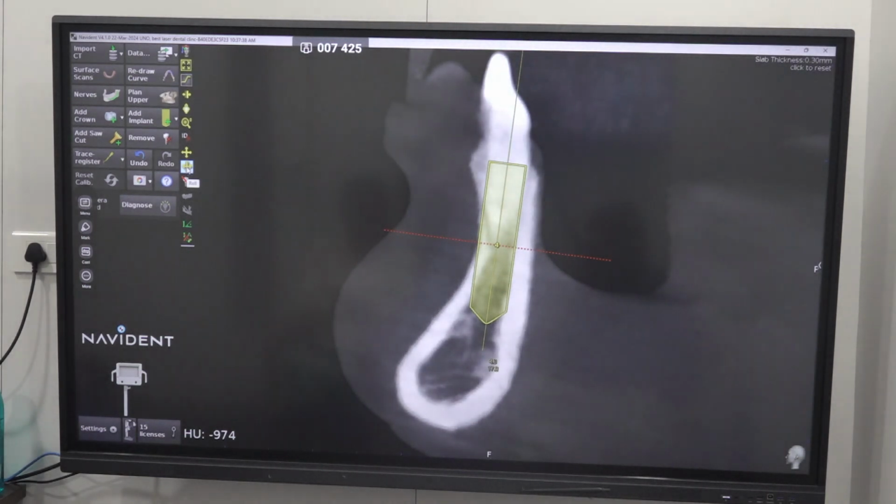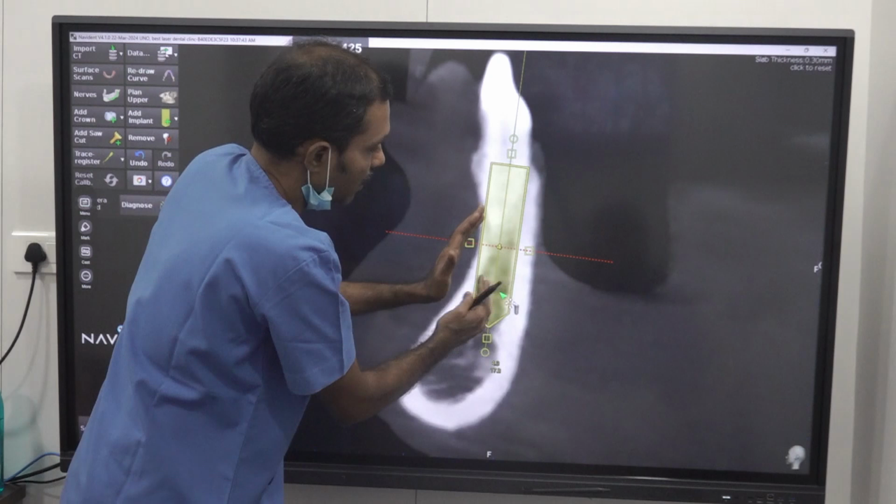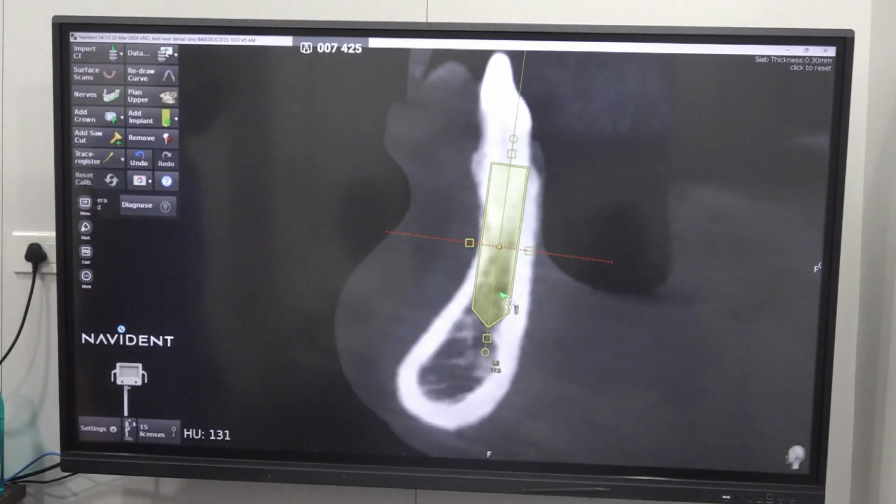This is the buccal lingual section. So if you use a 3.6, it will get buccal lingual cortical support. Or you can use a compressive also, provided you do nice curettage and nice irrigation.